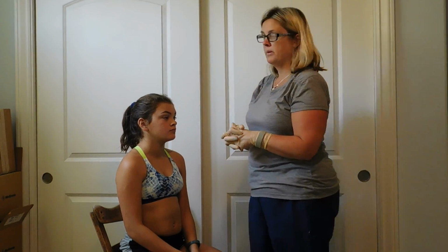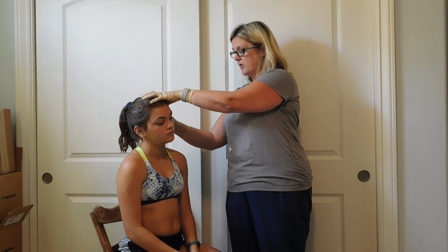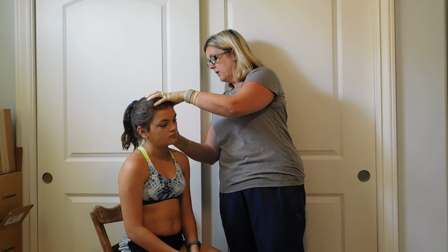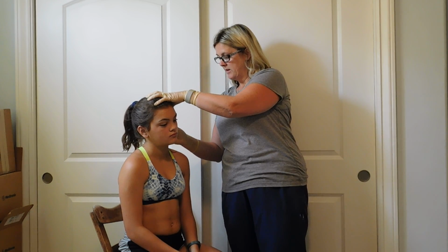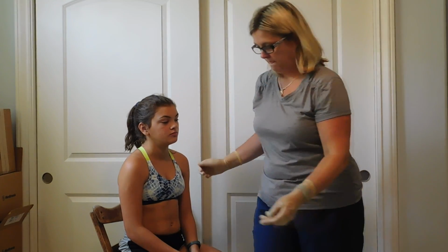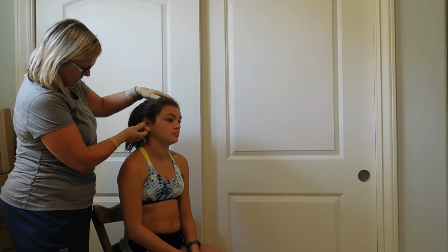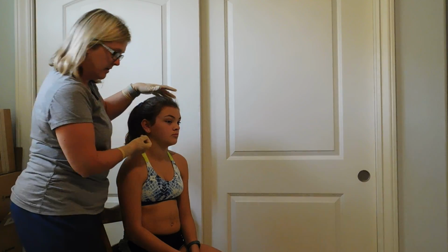Next, I will be completing Mairead's ear exam. I will complete a review of Mairead's ears. I will do an inspection of her ears. Her external auditory canal is clear. There's no redness. There's no exudate. Pinna are soft and non-tender. Do you have any pain in your ears? No. The other ear is normal. Again, there's no exudate or swelling or redness or drainage coming from the ear.